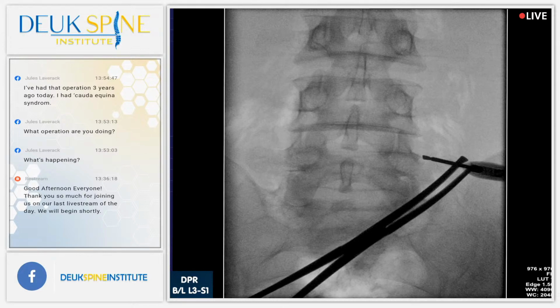And it lives right there on the x-ray. Jordan, show them where the medial branch of the dorsal ramus lives. Right there where my tip is. See that? And so I am literally trying to kill that pain nerve. And that's what we're doing here. And we've got, well, 7 of them done. We've got 1 more to go.